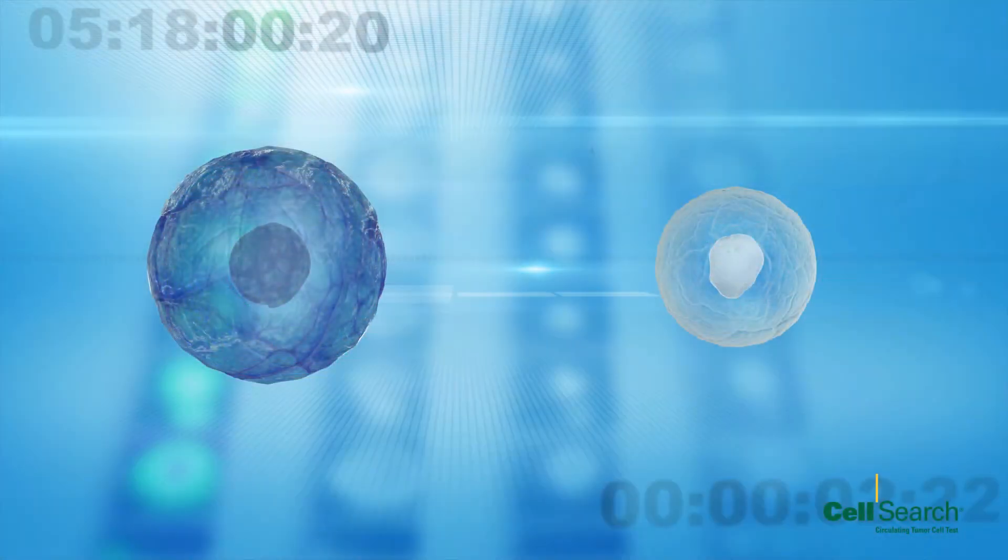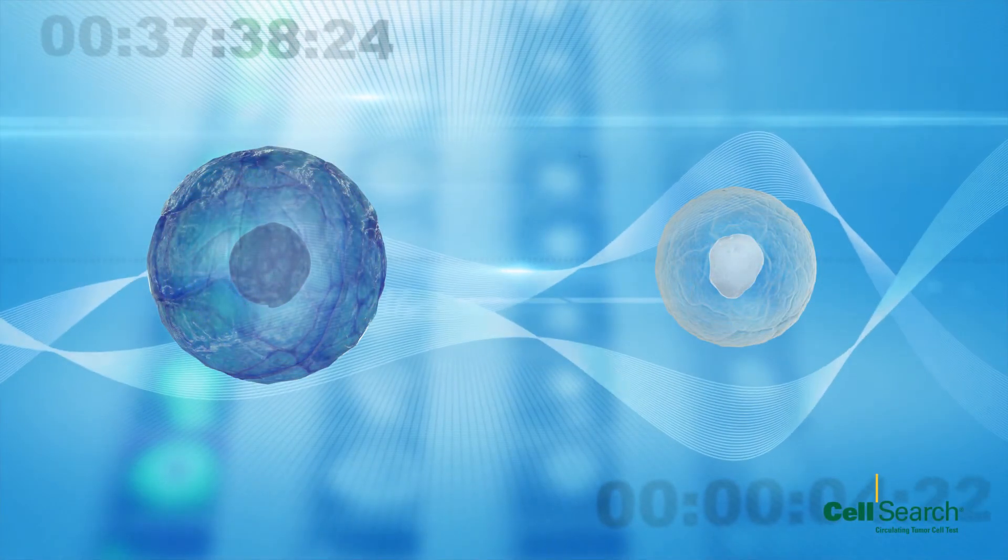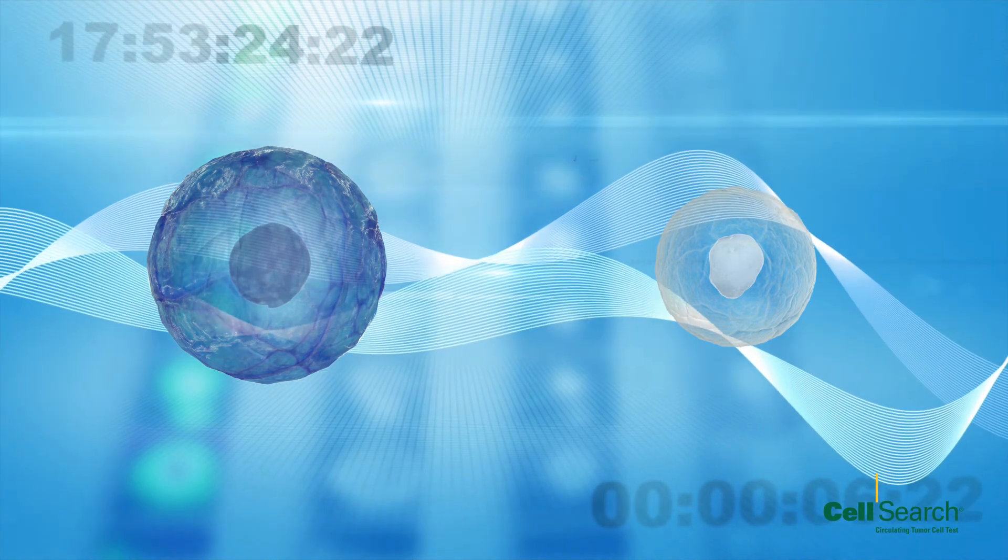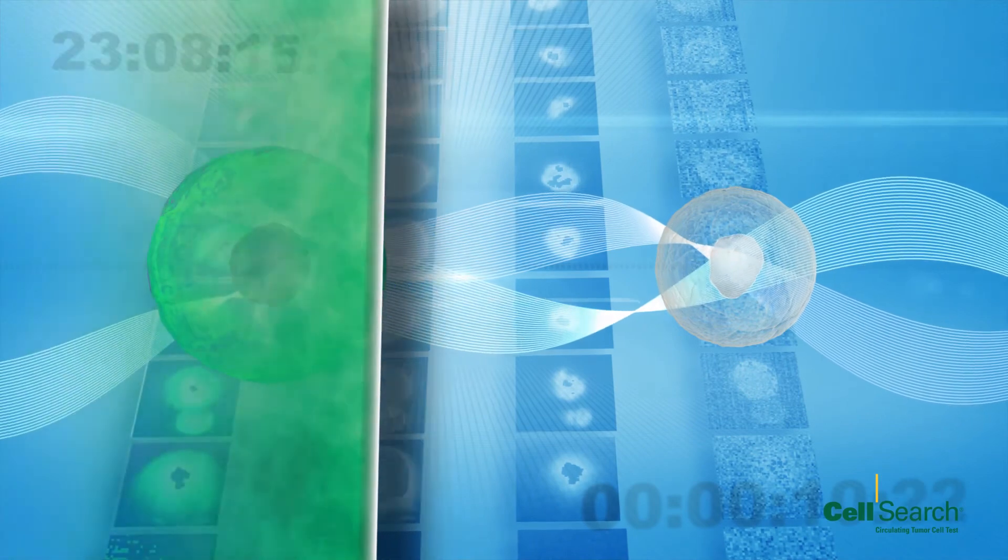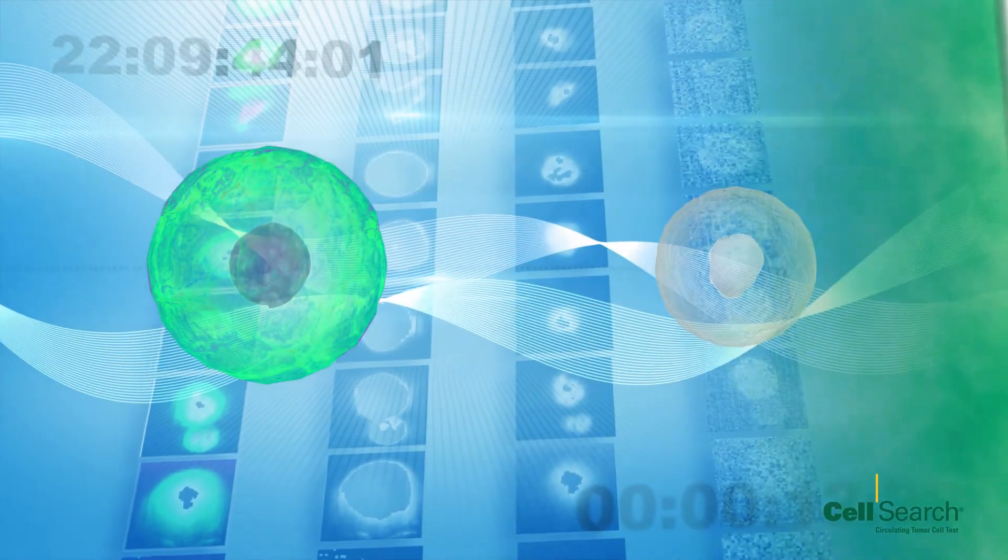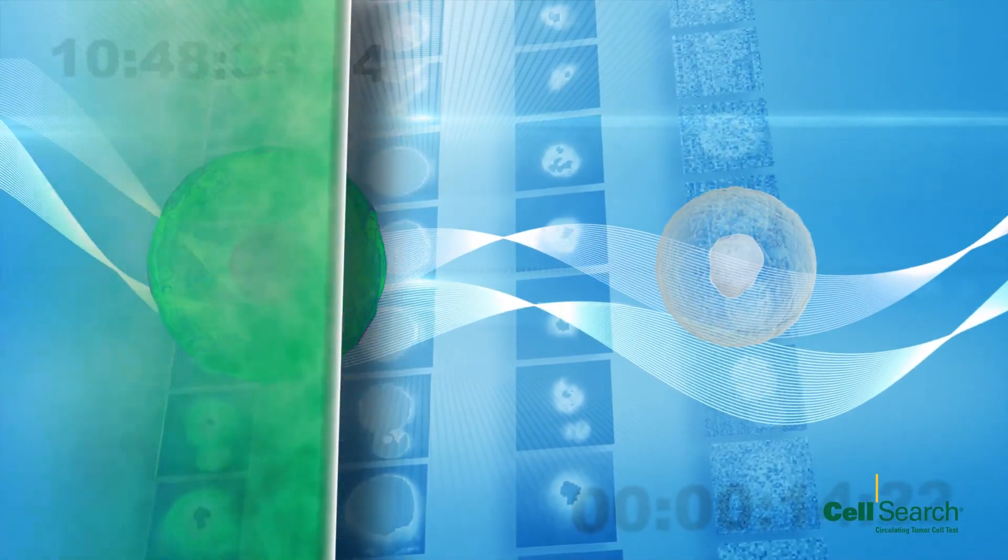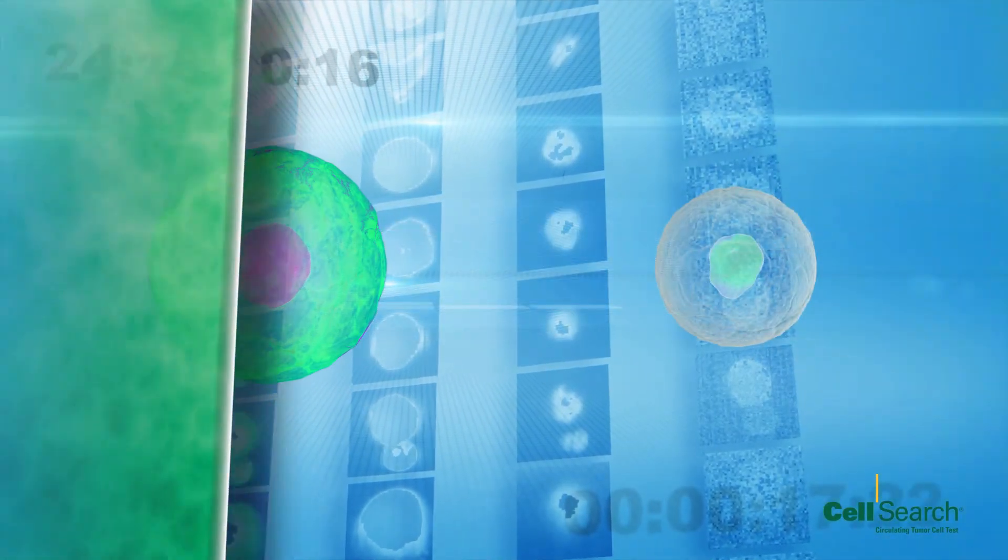The CellTracks Analyzer II records fluorescent events and presents images to the user for classification. By this process, CTCs are identified as cells that are positive for cytokeratin and DAPI but negative for CD45.